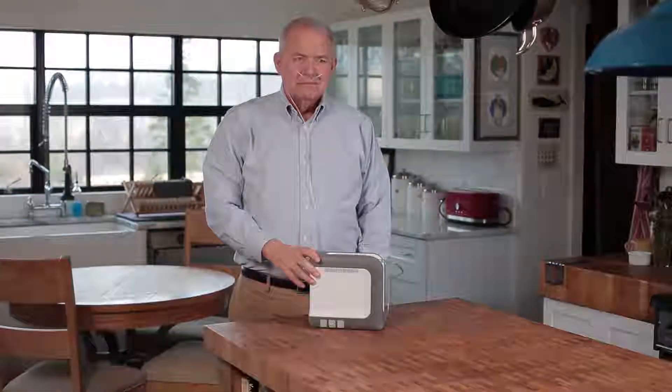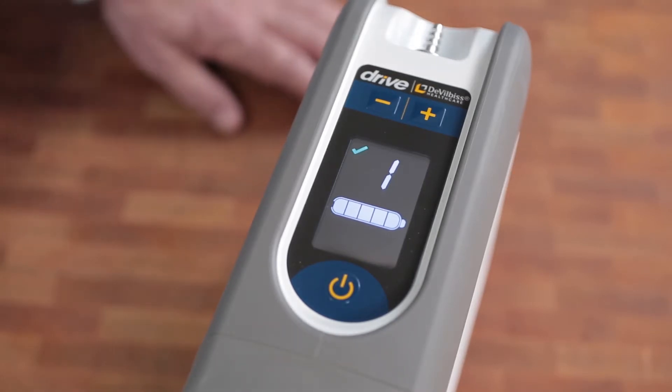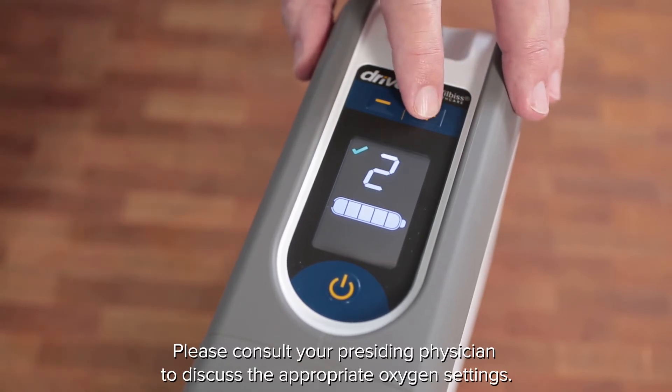The prescription setting on iGO2 will be shown in the main control panel. This should be set by your iGO2 medical equipment provider. The device has five settings.